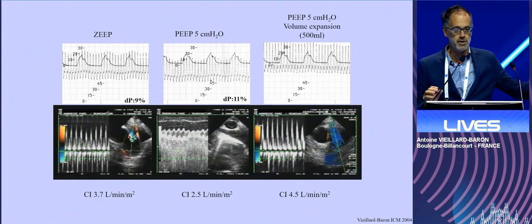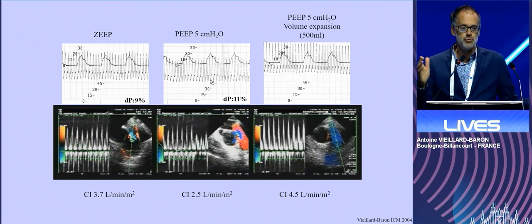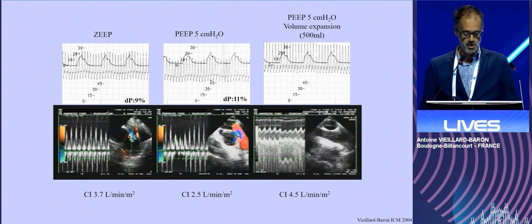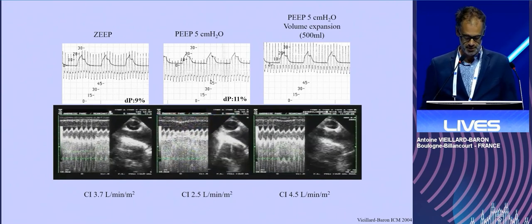And we improved the blood pressure a lot, no more pulse pressure variation, no more huge drop in the RV stroke volume, and no more collapse of the superior vena cava, with a very significant increase in the cardiac index.